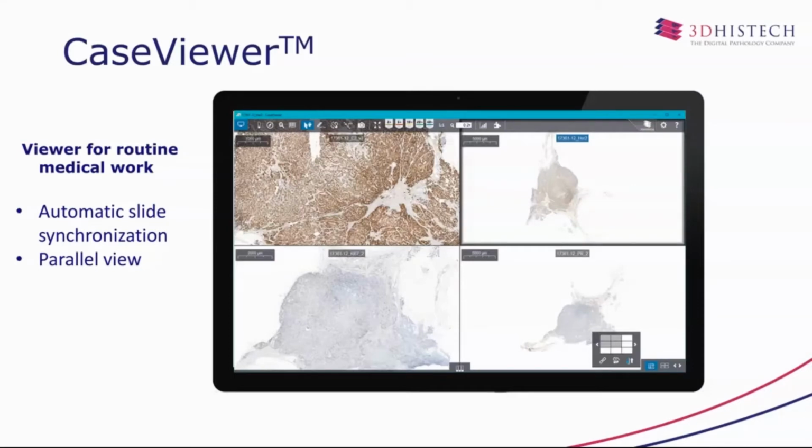Let me show you again the parallel view. As I already mentioned, probably this is the most important and the most useful feature of the software. On this screenshot, you can see the viewer basically showing 4 digital slides. All these digital slides were made, or actually the original glass slides were made from the same block. These are consecutive sections. Of course, they are stained with different antibody, with different stain.